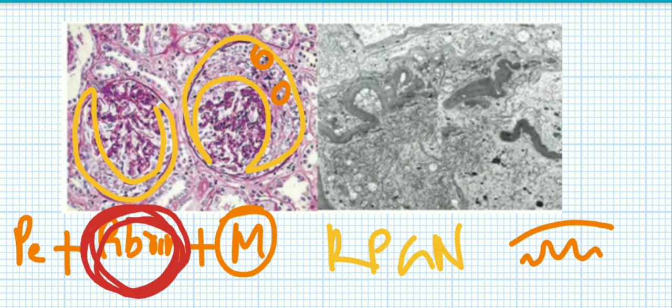So this is about rapidly progressive glomerulonephritis. Once again, just recall the statement: crescents are the characteristic microscopic finding of RPGN, and rupture of the basement membrane is there. You can see crescents in light microscopy, rupture in electron microscopy. That's all. Thank you.